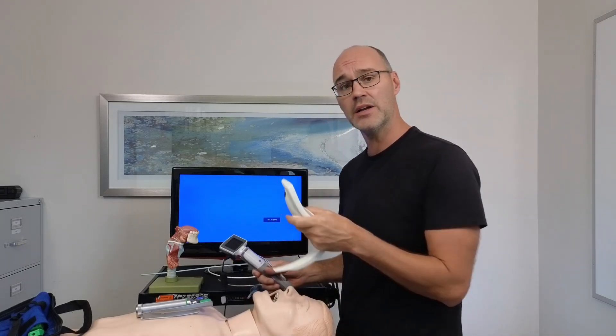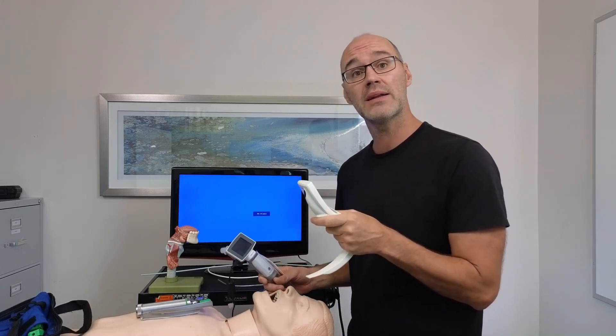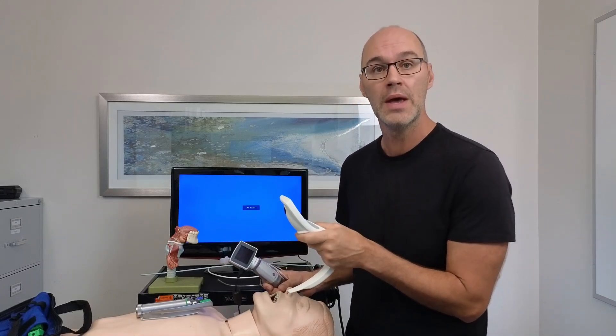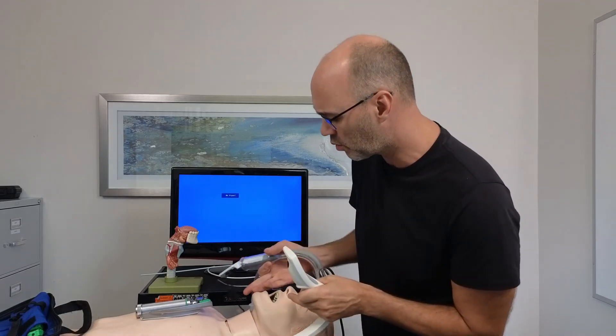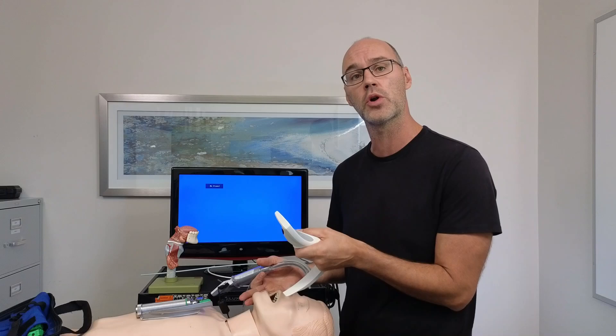With the Macintosh, not as easy to obtain the view, but typically easier to advance the tube. And that's because the Macintosh helps lessen that corner.